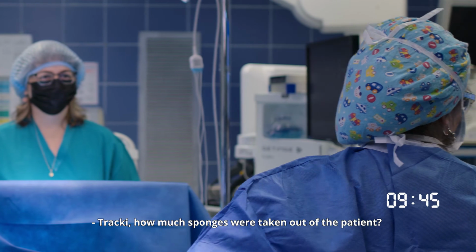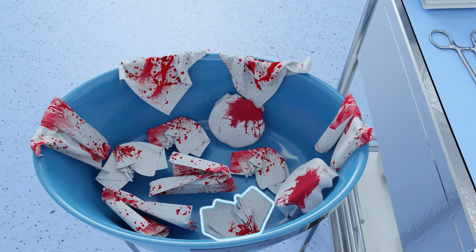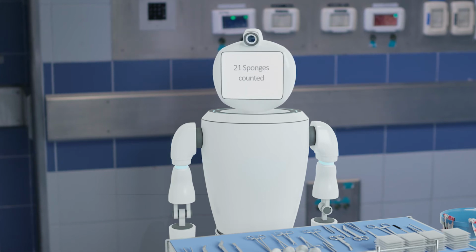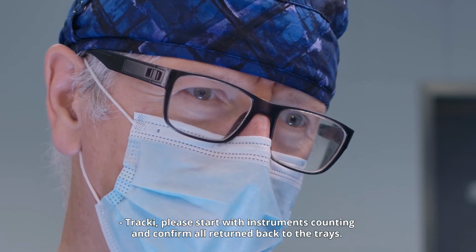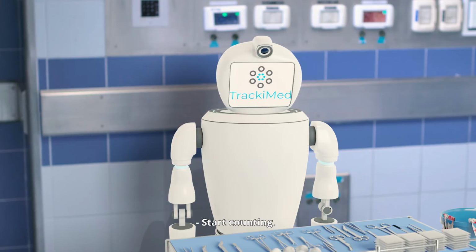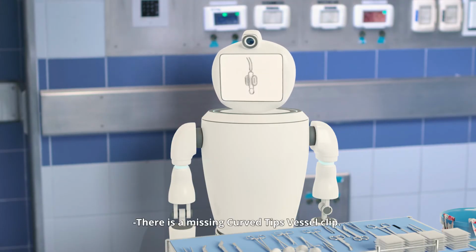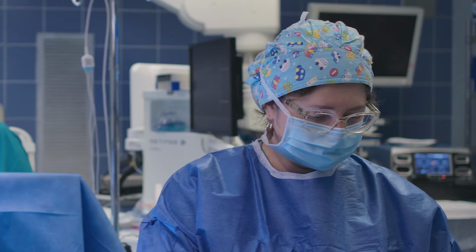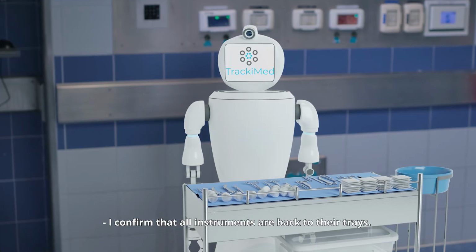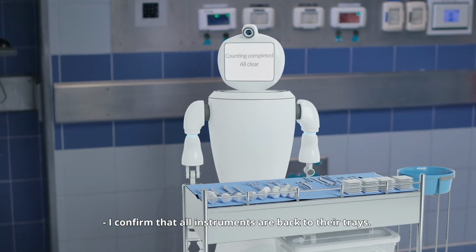Tracky, how much sponges were taken out of the patient? 21. Tracky, please start with instruments counting and confirm all return back to the trays. Start counting. There is a missing curved tips vessel clip. I found it. Tracky, please recount. I confirm that all instruments are back to their trays.